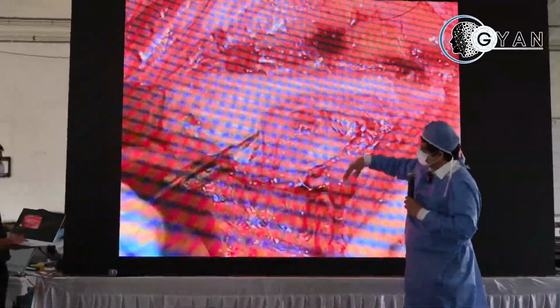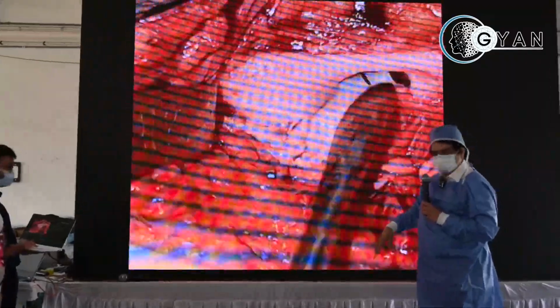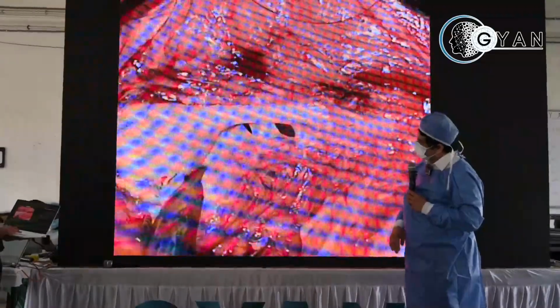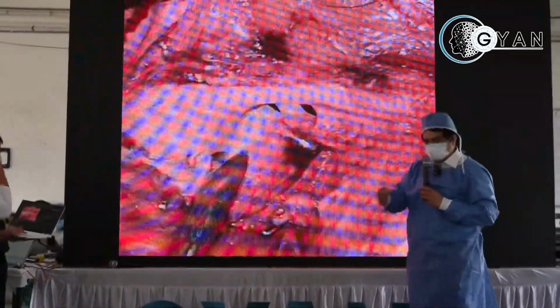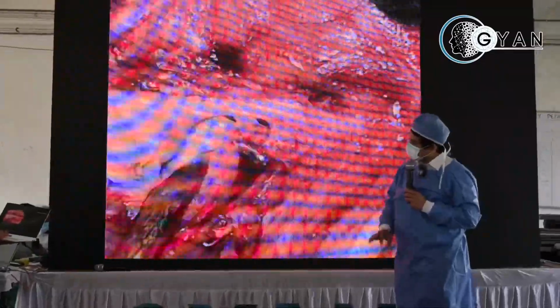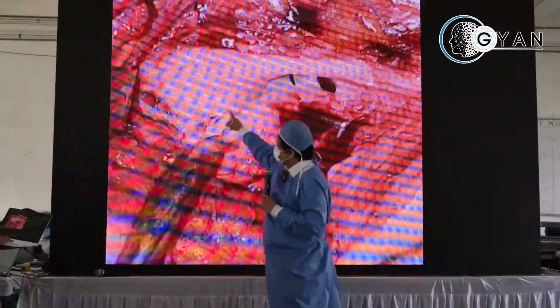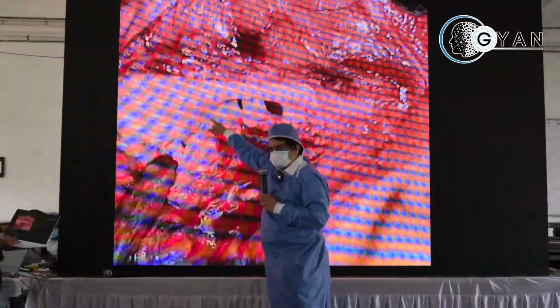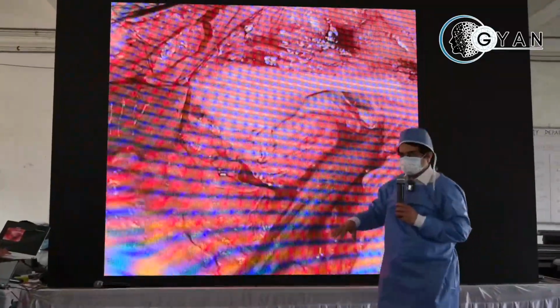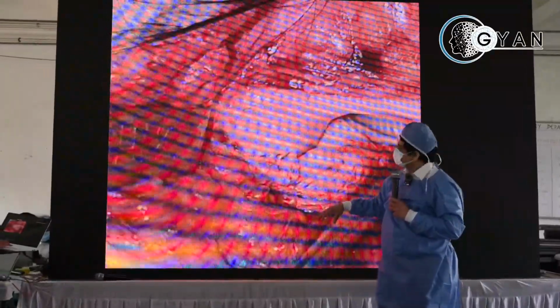And then like this, you detach the disc from the periosteum of the glenoid fossa and the articular eminence. Once this is detached, if you move the mandible, then you will see that you can clearly see the mandibular disc. Now, in the next step, if you want further exposure, you can cut the eminence. This will give you further visibility to the superior part of the disc. Now you can see clearly the perforations in the disc or any other abnormalities there.